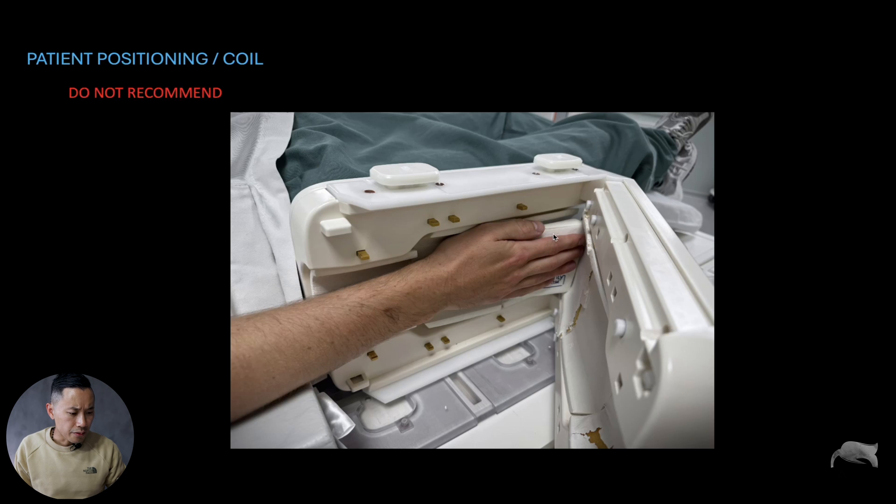You can see whenever we use the pads incorrectly, there are pads on one side of the finger and nothing on the other, which is not recommended. If you're going to use the oblique pad, put it in front so it pushes the hand into a straight line. If you place the pads like I'm showing here, they push the hand oblique rather than straight.